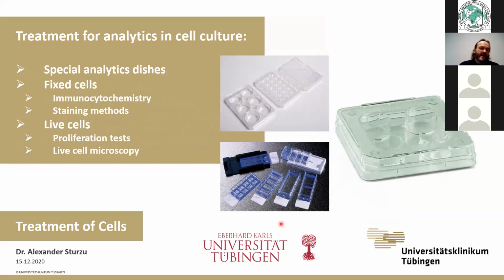And then the analytics in the cell culture. This is done either after previous treatment or the cells themselves are analyzed directly. And for these analytic methods, there are specialized dishes. I have given you a few examples here, these dishes for the ELISA readers, or here cell culture microscope slides where you can grow the cells directly on the slides. And we differentiate in here with the fixed cells or live cells.